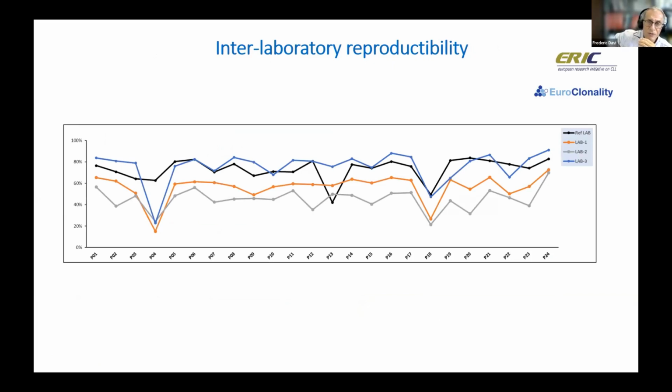There again, we also did an inter-laboratory reproducibility test under exactly the same conditions, and it worked very well, with a difference that with cDNA we observed quantitative differences which were a bit more marked than with genomic DNA, though that may be linked to cDNA degradation.